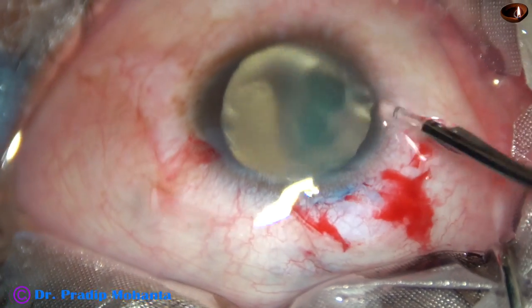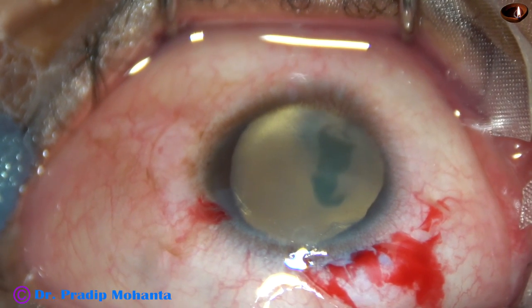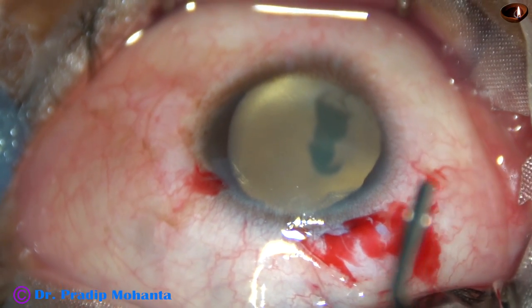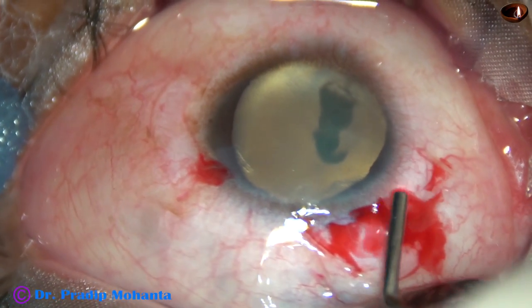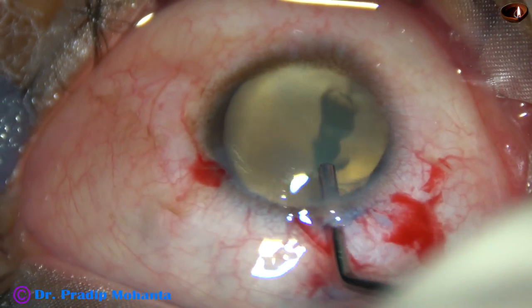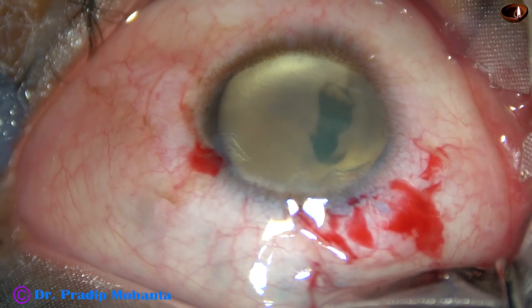Now I am washing the dye out. And now a viscoelastic substance, 2% hydroxypropyl methyl cellulose, is being injected into the anterior chamber. The anterior chamber is filled with this visco.